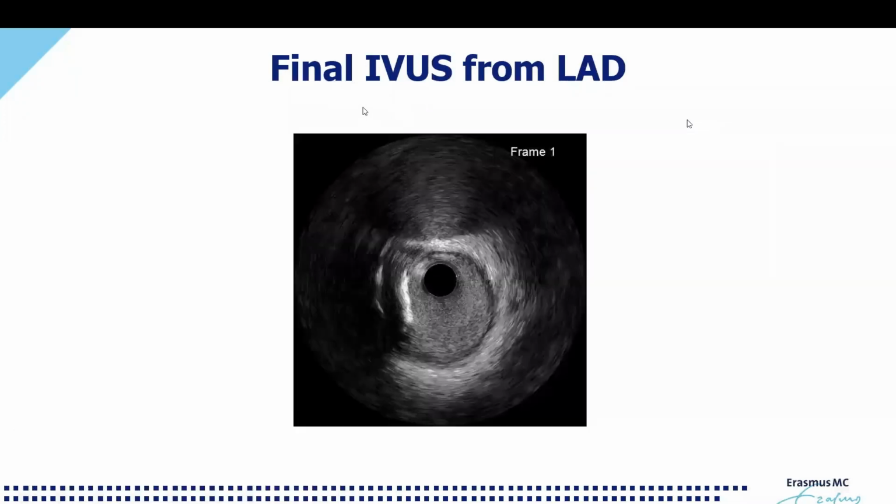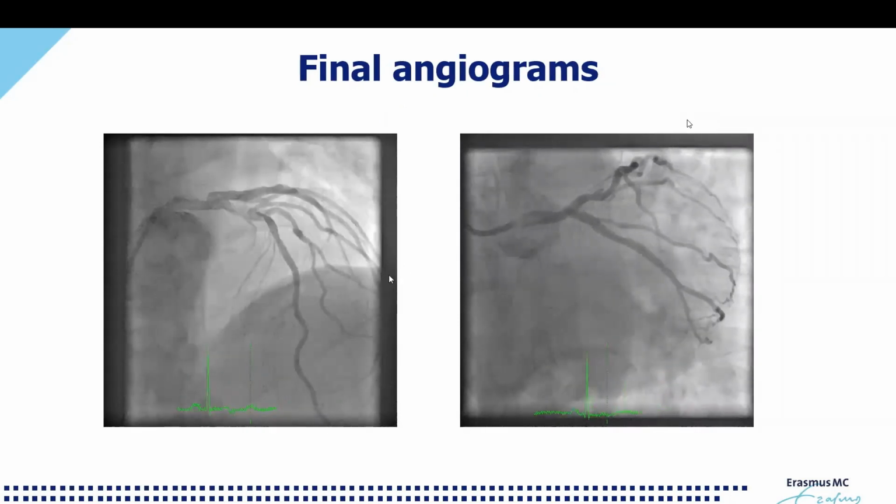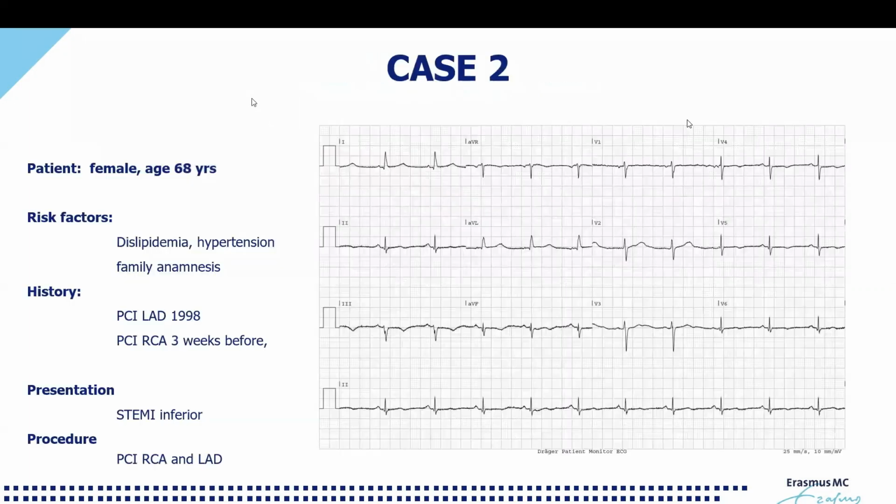And now with this one, we really called it a day for this patient. And these are the final angiograms. And you see it looks more, I think that we will have a happy patient in this one.